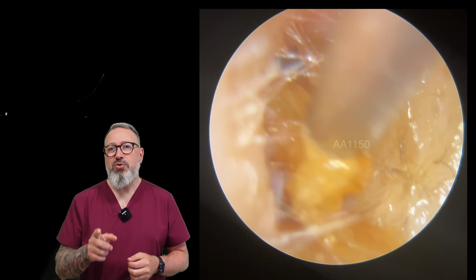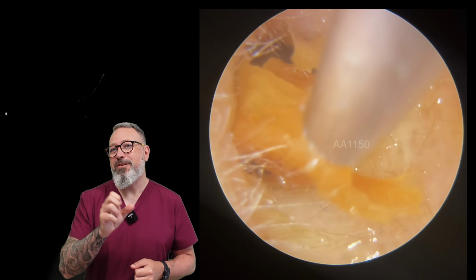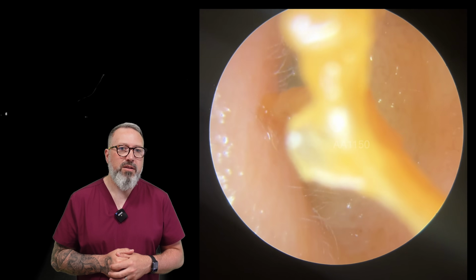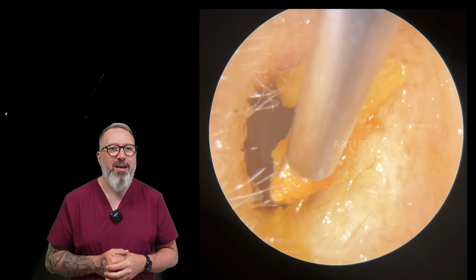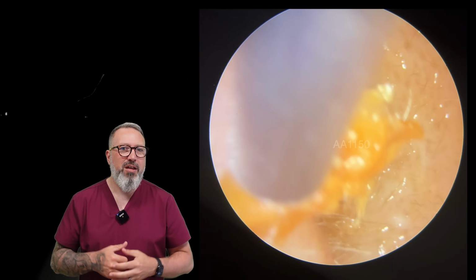Oh, I do have, for the next one, little mini skin ribbons coming up for you, guys, so make sure you stay tuned for that one as well. But this is coming away really well. Look at that peeling. Oh, I think that would have almost been a really good skin ribbon there. So just peel away this edge. Yeah, you can see how it would all kind of bunch together in that canal.